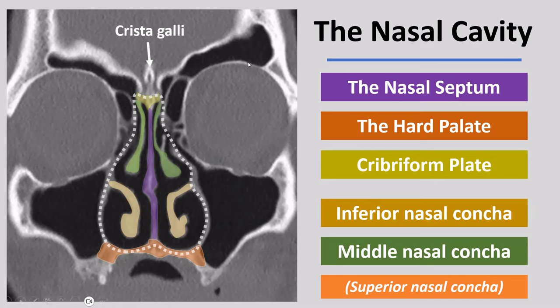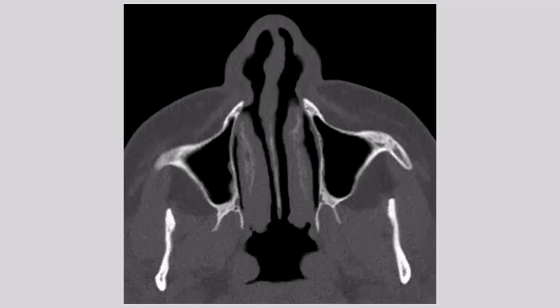We also have a bony structure that is an extension of the ethmoid bone — the crista galli — which divides the olfactory fossa, located here and containing the bulbus olfactorius (the olfactory nerve), into two sides. The crista galli is a bony structure which can sometimes be pneumatized but often is not. The nasal septum divides the nasal cavity in two parts. We see a cartilaginous part anteriorly and a bony part posteriorly — more about that in the next slide.